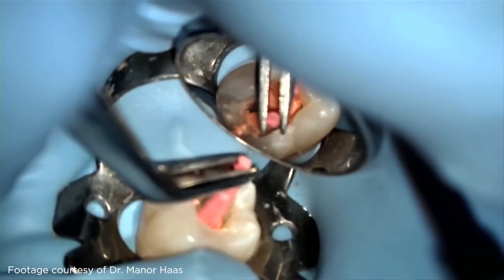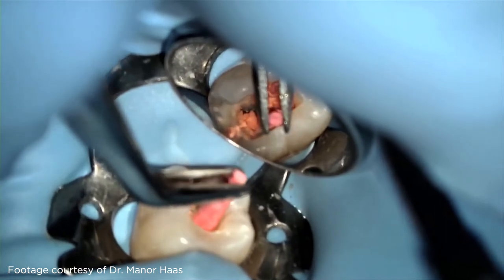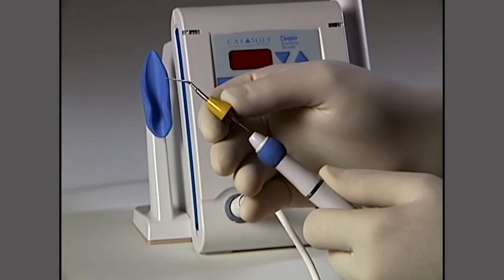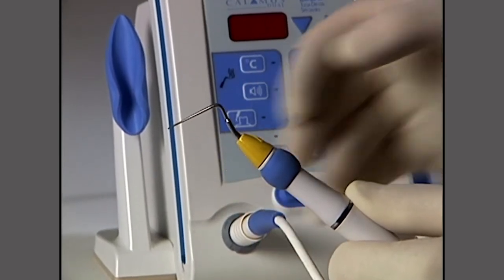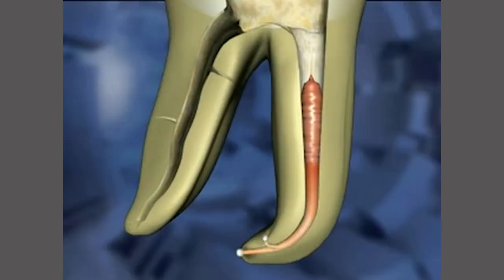While GuttaCore provides a full condensed fill, I typically follow this with careful and gentle warm vertical condensation of the softened Gutta Percha with the Calamus condensers, starting with the large green and finishing with the small yellow. This allows for hydraulic movement of sealer into lateral and accessory canals in addition to moving sealer into multiple canal exits at the root apex.